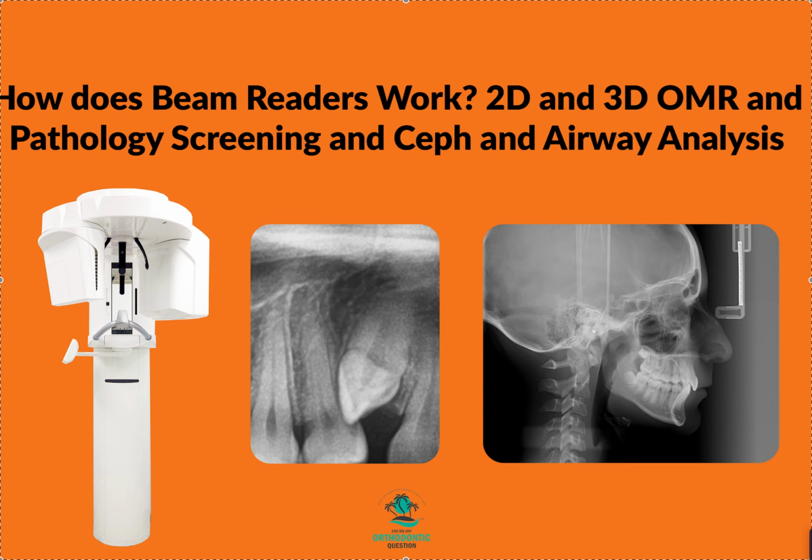With Invisalign, now that you can upload the CBCT, you have a little more control, although I find that it's not great. Things like pathology are not going to show up, and supernumerary teeth don't show up very well. It's okay for things like impacted third molars, but for everything else, it's not great. Remember, it's relying on AI, and it's a new function. I still would rather that you get that report officially read.